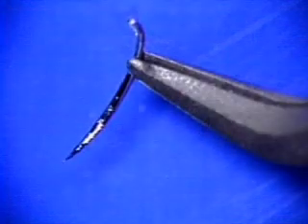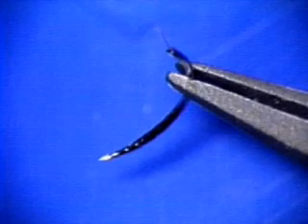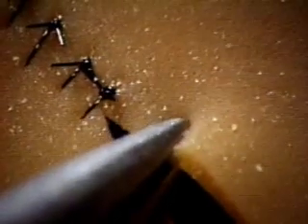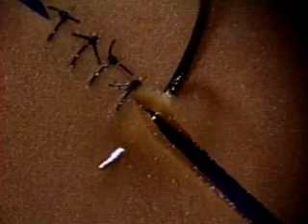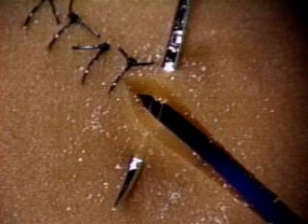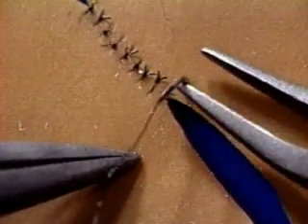We've looked at picking up the needle, passing it through the tissue, and pulling the thread through, and we're about halfway through this tape. At this point, I'd like to review some of the classic pitfalls that I've already mentioned. First, in picking up the needle, avoid these mistakes. Picking it up with the wrong part of the needle holder, or at the wrong point on the needle, or at an unstable angle. Avoid picking up the full thickness of the tissue. Avoid taking bites that are too large or bites that are unequal, and avoid passing the needle obliquely. Also, avoid letting go of the needle halfway through.